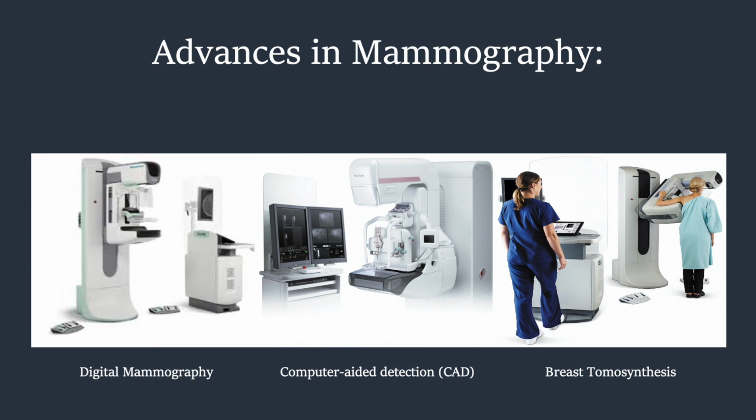Let's talk about advances in mammography. We have digital mammography, we have CAD, which is computer aided detection, and we also have breast tomosynthesis. Digital mammography is a mammography system in which the X-ray film is replaced by electronics that converts X-rays into mammographic pictures of the breast. Its efficiency enables better pictures with a lower radiation dose. These images of the breast are transferred to a computer for review by the radiologist and for long-term storage.